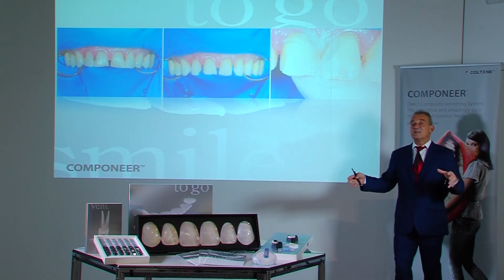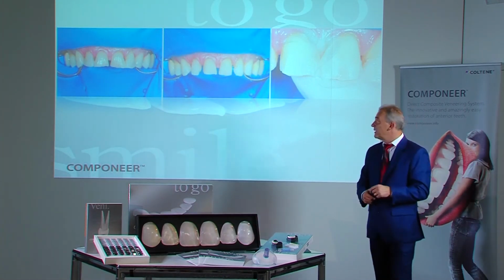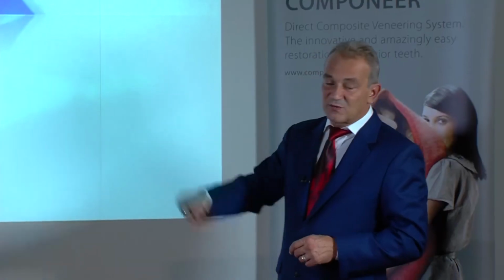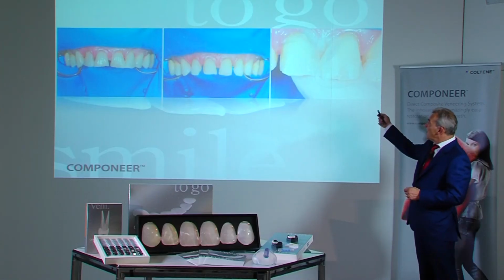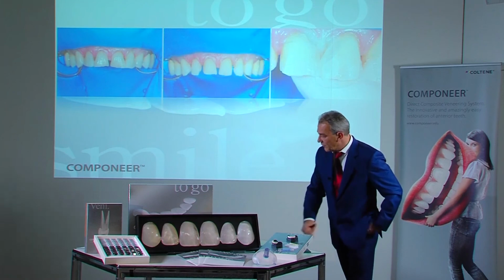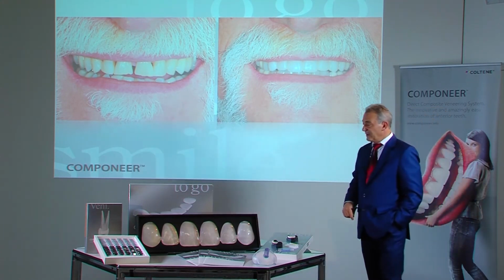Why? Otherwise, the teeth would become too wide and the proportions between anterior and lateral teeth would no longer be correct. This is why some substance was removed distally from the preparation to have space for mesial build-up and to retain the proportions. Here you can see the matrix in the sulcus and how the contact point is being filled to mesial. And at the same time, we have no occlusal interference in the incisal region.